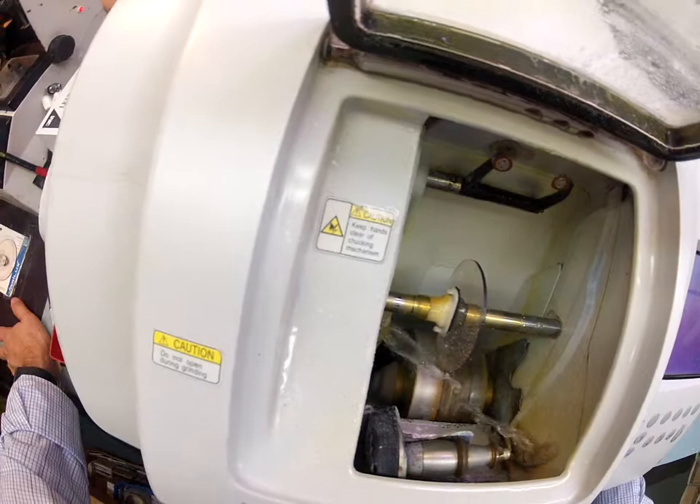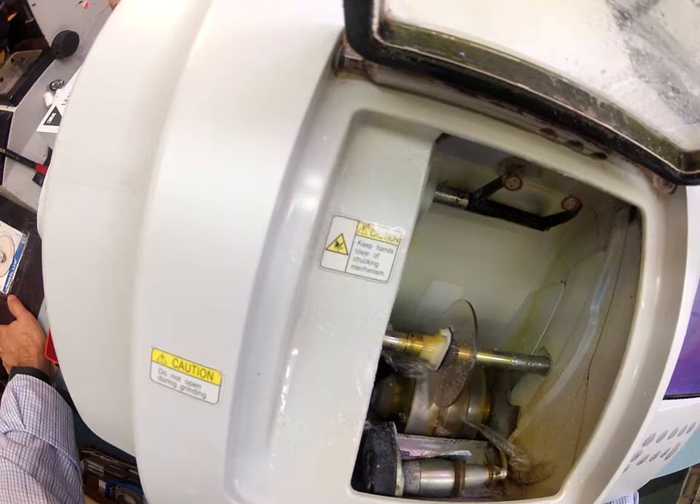I will have to close the door in a moment due to the sound, but I want you to see as your transition lenses touches down onto the cutting wheel.